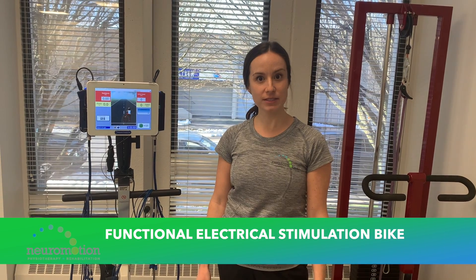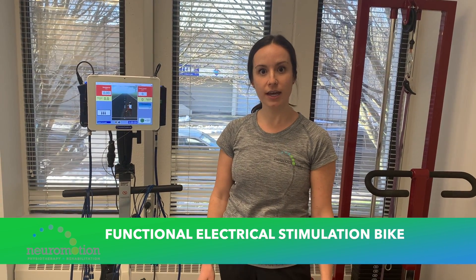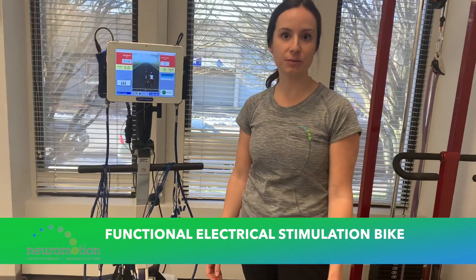Hi, my name is Melissa. I'm a physiotherapist here at our Victoria location, and I'm going to show you our functional electrical stimulation bike.